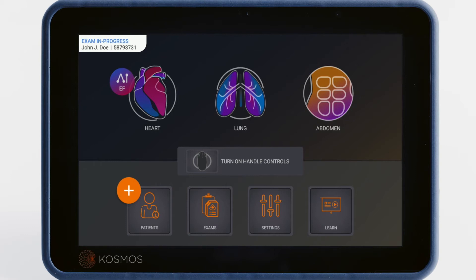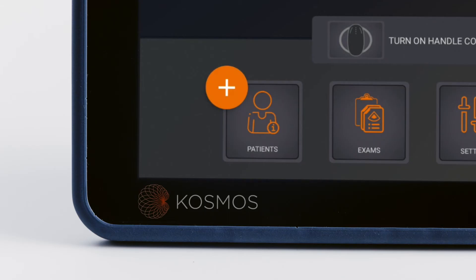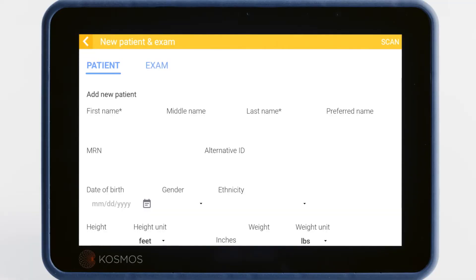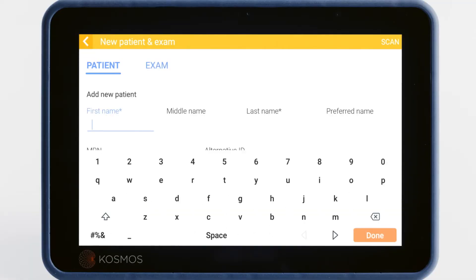If your Cosmos is not connected to a Health Information System, return to the home screen and to add a new patient, tap the orange plus sign. In the form, first and last names are required. If you leave the MRN blank, the system will automatically assign one.